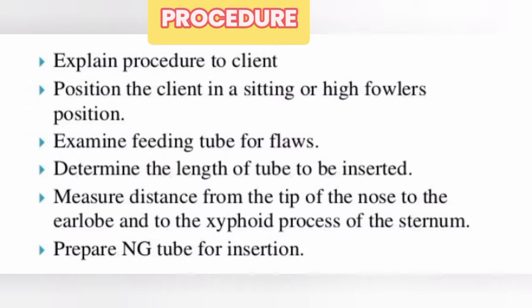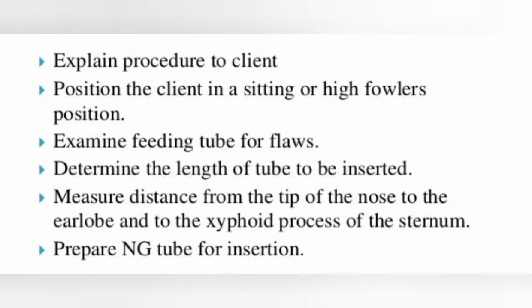Then we have to measure the distance from the tip of the nose to the earlobe, then to the xiphoid process of the sternum. Afterwards, we need to prepare the NG tube for the insertion process.